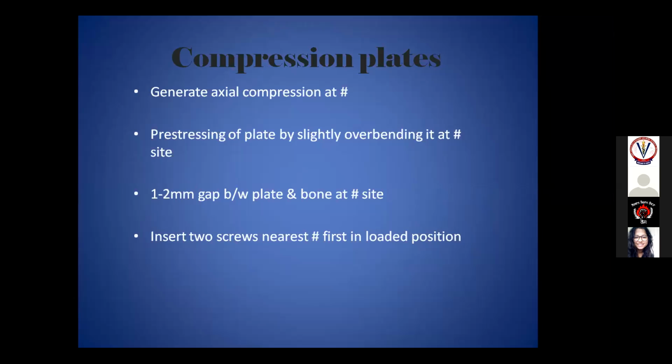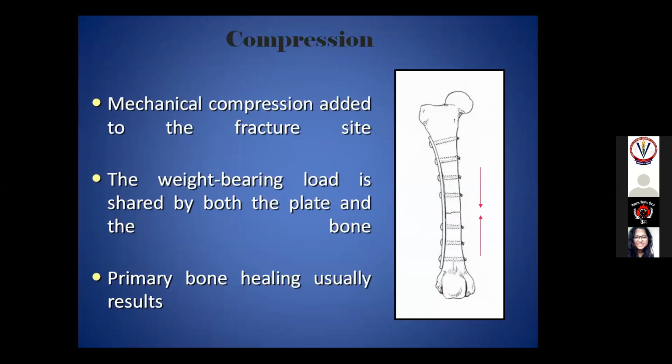If the fracture is a simple transverse fracture, for example, this is a simple transverse fracture.